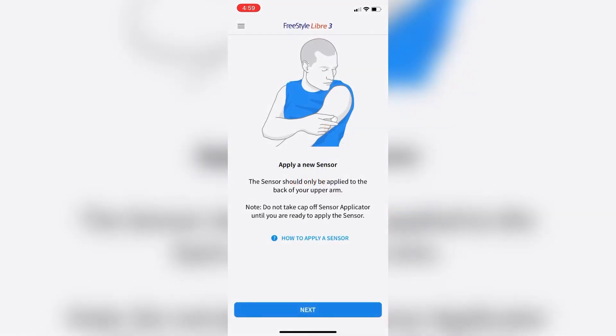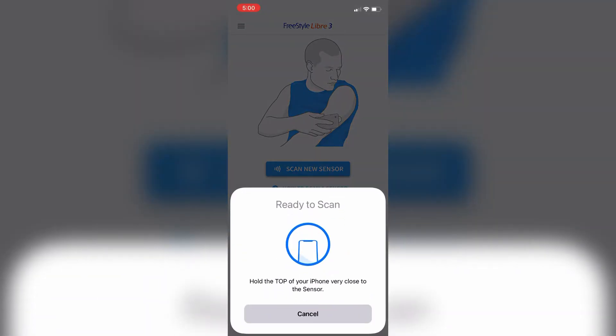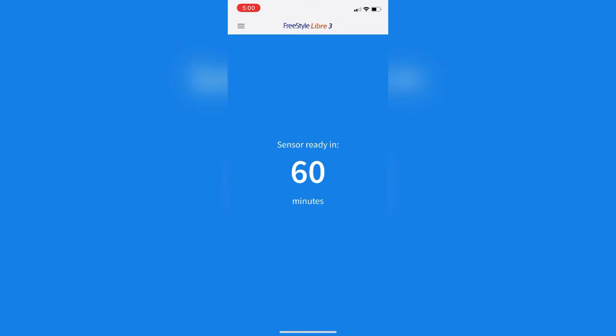Let's get it set up in the app. Open up the Libre app again, click next, and in the middle of the screen click 'Scan My Sensor.' It's going to prompt you — hold your phone up against the sensor. Once it's registered, give it a check mark. There's also an alert reminding you not to take high amounts of vitamin C.